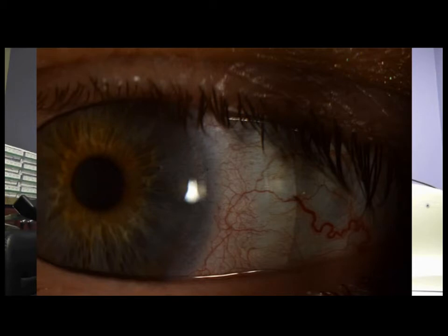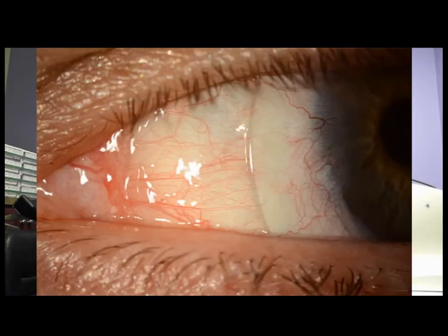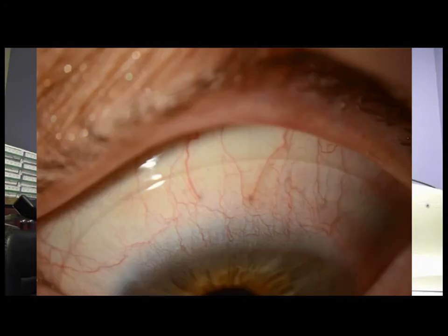Now, look over to the right. At the haptic, we're looking for any compression. Look up for me. Look to the left now. Very mild compression, almost imperceptible. Look down now. And superiorly, it looks great. Okay, sit back.